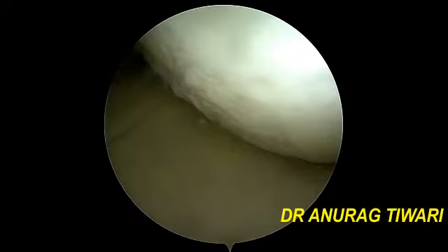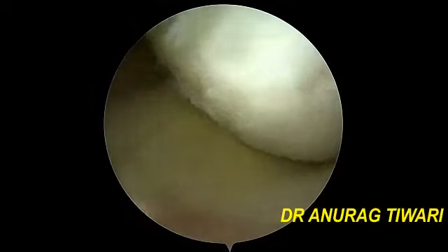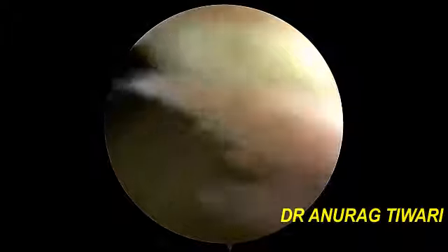Hello everyone, myself Dr. Anurag Tiwari, and today I will be demonstrating arthroscopic ACL reconstruction in an ACL deficient knee. So this is a technique which is done arthroscopically. So this is the camera view you are seeing.